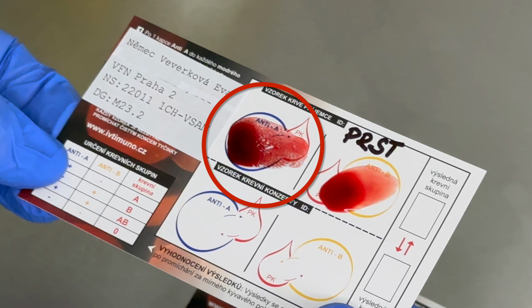In adults, transfusions are usually administered via a peripheral venous catheter of 18 gauge. The minimum recommended size is 22 gauge. Transfusions may also be administered through the distal lumen of a central venous catheter.